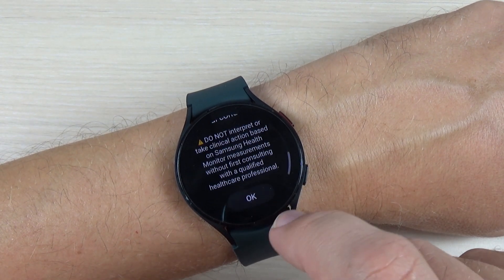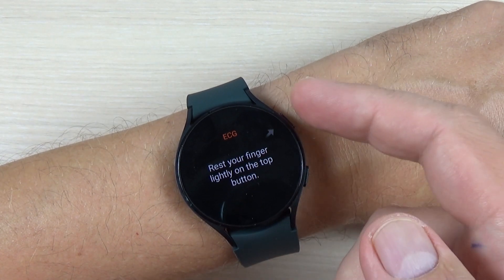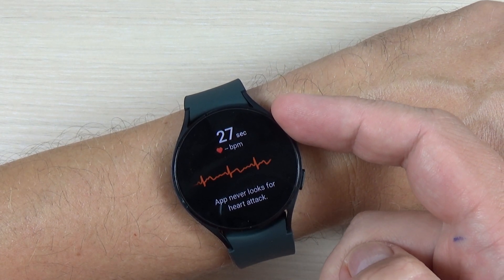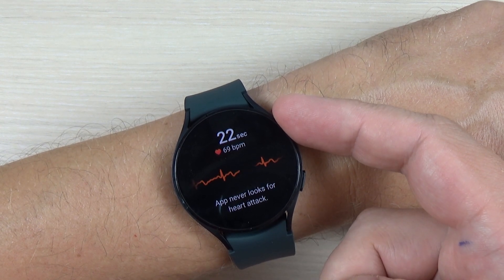Make sure the watch is snug on your wrist, press OK, and rest your finger on the top button. Now you must wait for about 25-26 seconds until the recording is over.